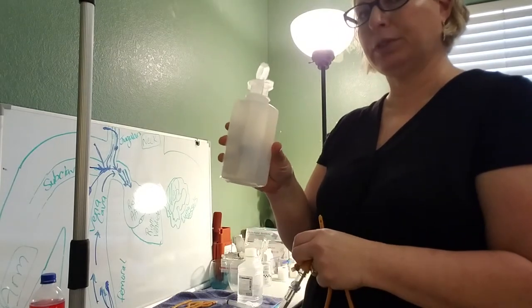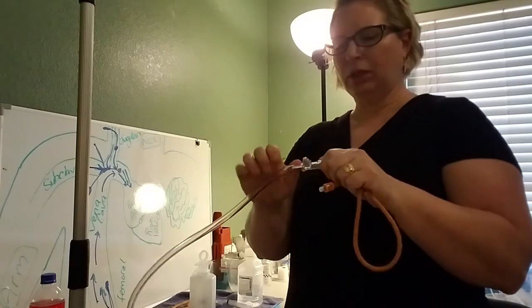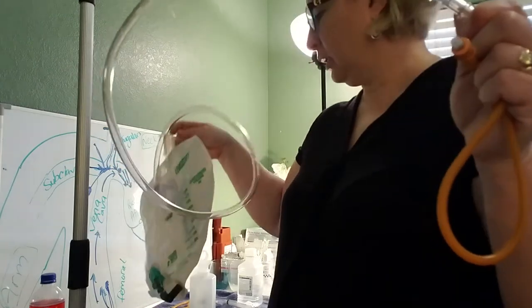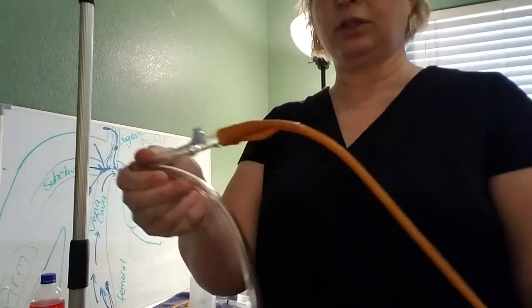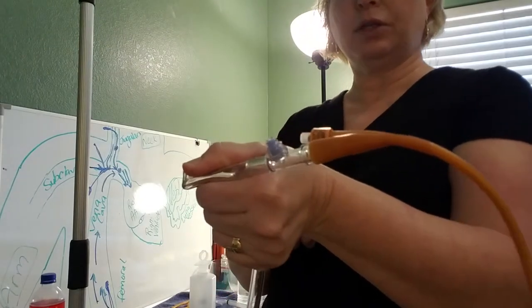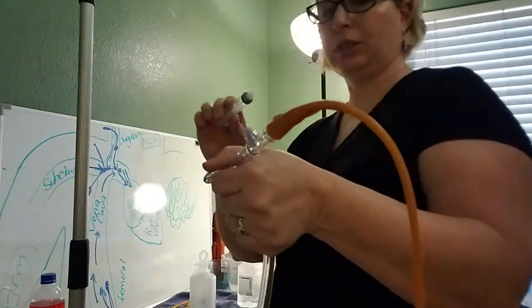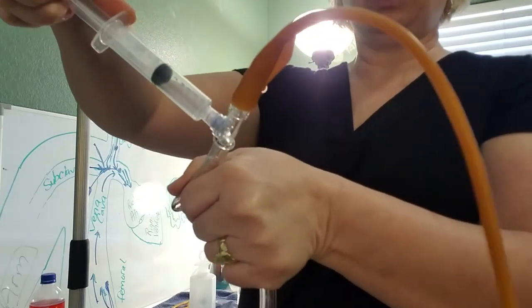You'd be using a separate syringe for a Foley catheter that has sterile urine in it. If you need to draw anything out of here to get a sample, what you would do is clamp it — this one is missing its clamp, but they have different clamps. You would want to clamp the drainage so urine doesn't escape, and you could pull urine out. Clean this port with chlorhexidine, let it dry, and then attach a syringe. Syringes fit on there just like a regular syringe, and you can pull a sample out of the catheter.